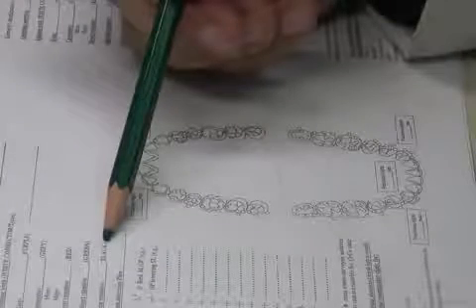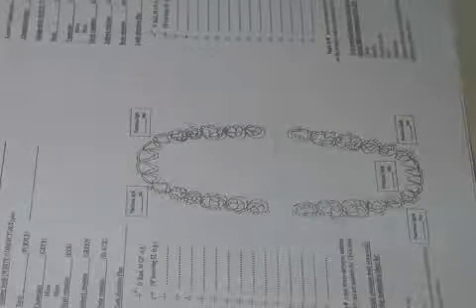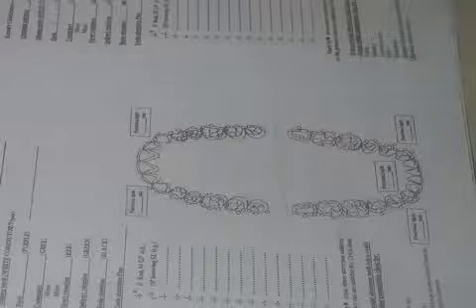Then we're going to talk about the connectors, major, minor, direct retention, indirect retention, resin retention area. We're going to decide on it, and then do the tooth alteration plan. I'm going to concentrate a bit on the tooth alteration plan because this is where major problems happen in the clinic for clinical students, fifth-year clinical students when they're doing RPD.